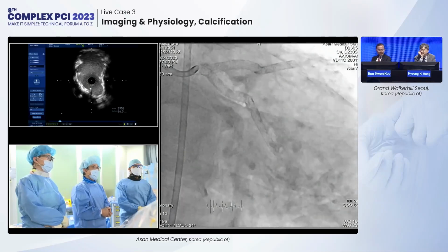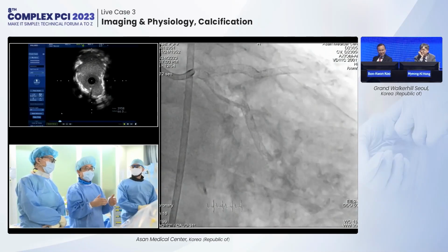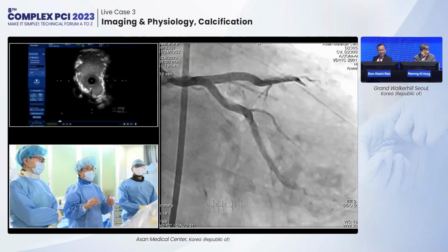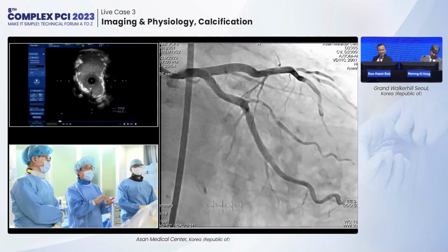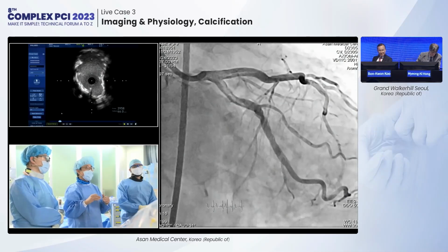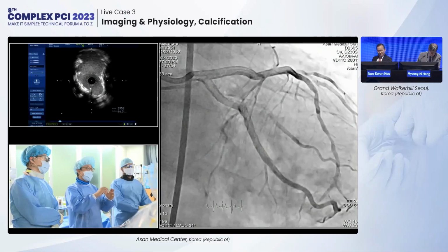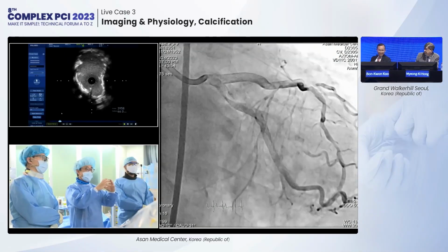Yeah, so I think that is a very important point. The DK crush is a wonderful double stenting technique. DK crush specifically emphasizes POT and re-POT. So I think we sometimes do POT. If we were going to do it in this case, we would do additional POT and make a more concentric configuration, as shown in the IVUS.